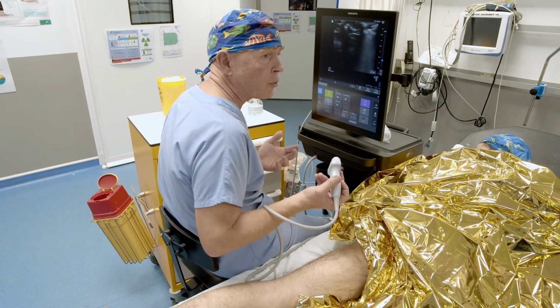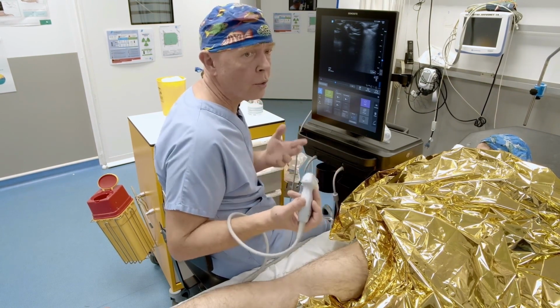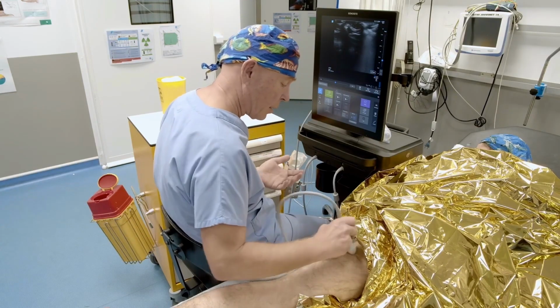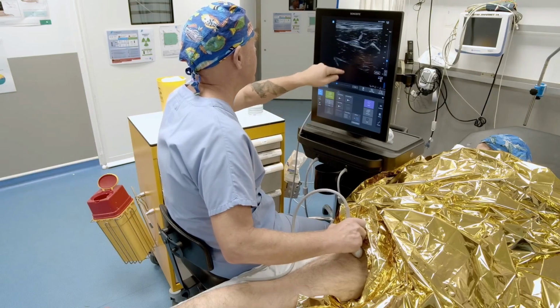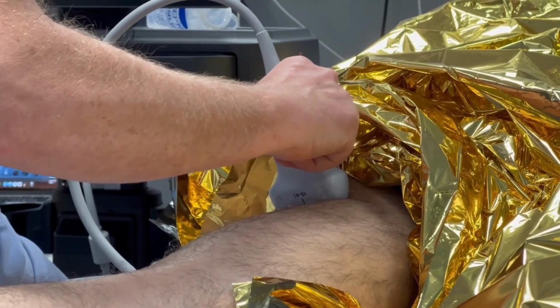The same goes for the workshop. You can also practice the sciatic block on a volunteer. So for the sciatic block, using the subgluteal approach, you place the probe here, a bit on the external side. And you can see here that we have a perfect image of what we saw earlier with the appearance of the sciatic nerve. So there you go, we can position it very well.